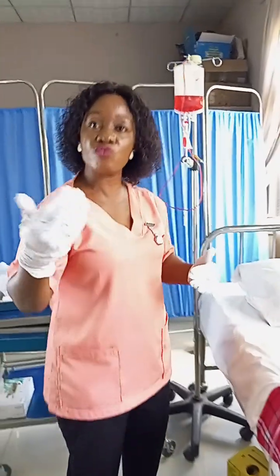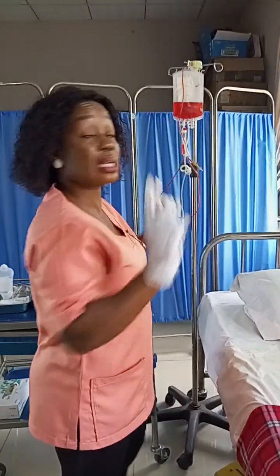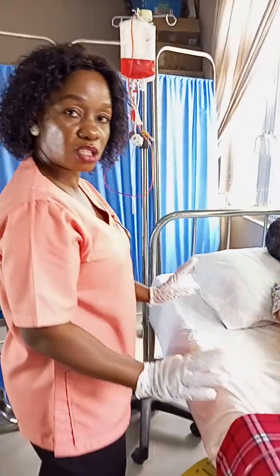You have to keep it for at least 48 hours in case of a post blood transfusion reaction. But in case the patient reacts to the blood during the transfusion, do not forget, immediately discontinue the blood transfusion.